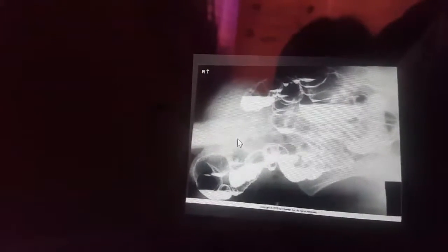Our next image that we're evaluating is our left lateral decubitus. For this image, you're just making sure that there's evidence of proper collimation. Also, that there's no rotation of the patient as demonstrated by symmetry of the ribs and the pelvis. Here we can see part of the ribs, and then spine, pelvis down here below this area.